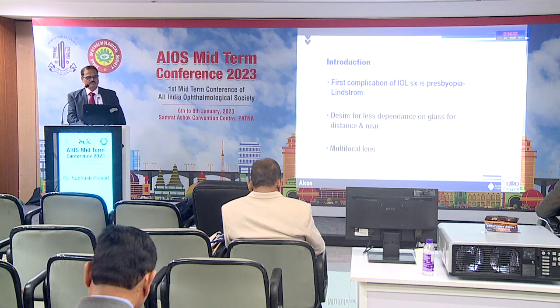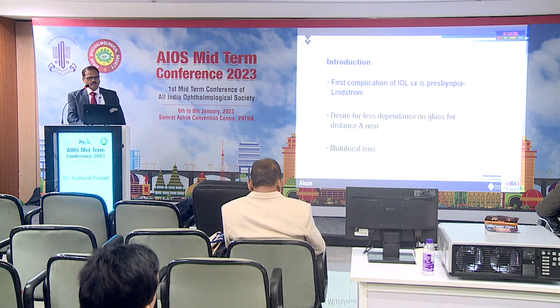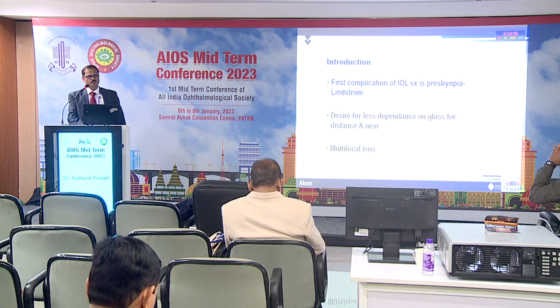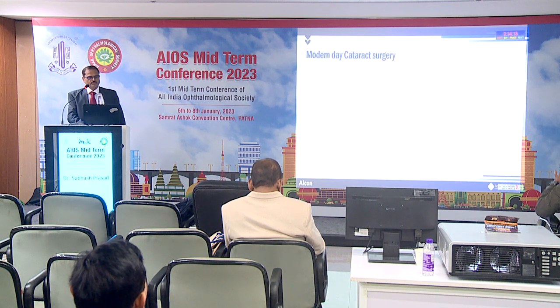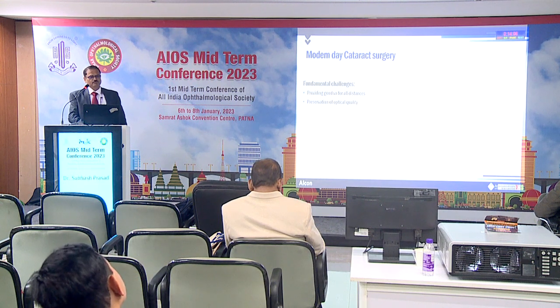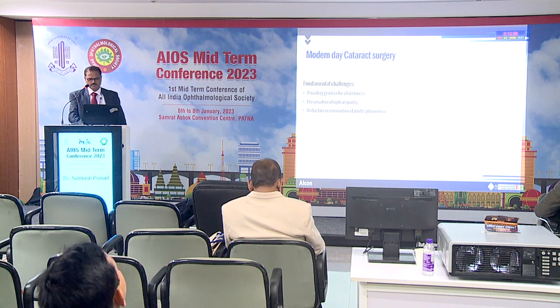That name was suggested by Lindstrom way back, and everyone has a desire to be less dependent on glasses with time and after cataract surgery, and that led to the invention of different types of lenses, including multifocal lenses. So in modern-day cataract surgery, the fundamental challenge is providing good vision to the patients for all distances, with the preservation of optical quality and with the reduction or elimination of the various photic phenomena.